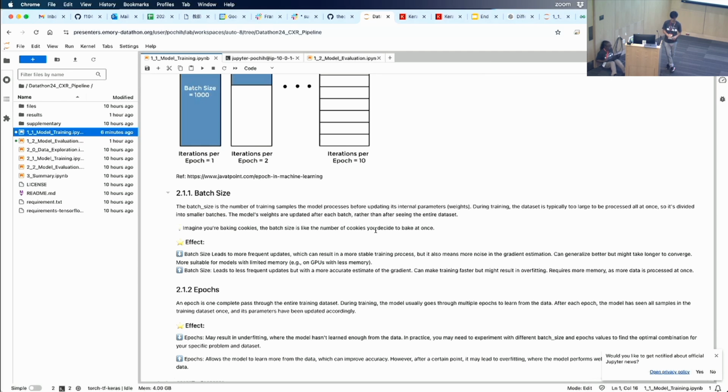So every iteration we calculate the loss function, and ask the AI, just based on this small batch, like probably just 10 images, try your best to minimize your loss. Okay, but that won't be perfect because you only see 10. But it's good, right? Better than nothing. So now I give you a second batch, another new test. You optimize yourself again, you keep repeating this until you go through the entire 100K. So now you're a lot better than from scratch, but still won't be enough because every time you only see 10 rather than 100K. So that's why we need to run a second epoch.